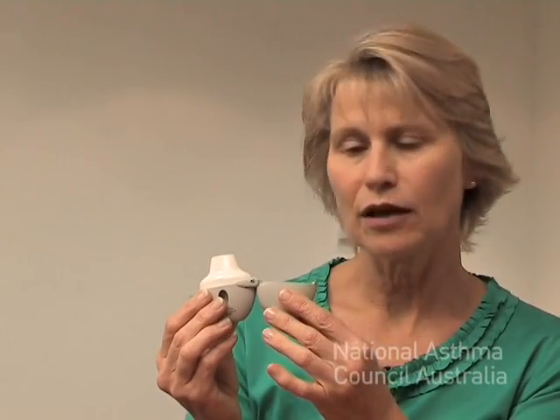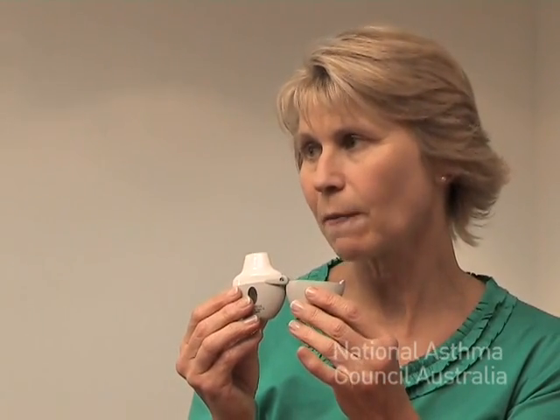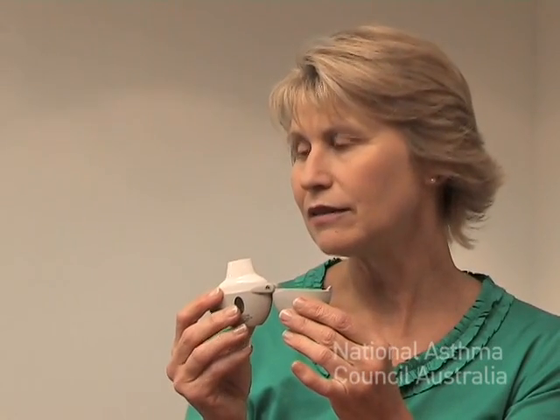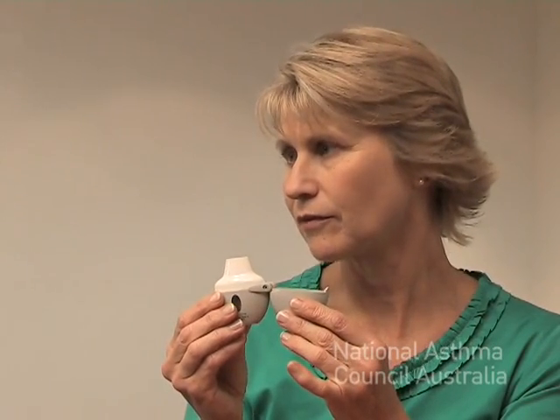Breathing out gently until you're comfortably empty, with the device away from your mouth. Then placing the device in your mouth with a good firm seal with your lips around the mouthpiece. Breathing in so that you can hear the capsule rattling and vibrating, and continue to breathe in for as long as you possibly can. Slipping the mouthpiece out of your mouth and then just breathing out slowly.